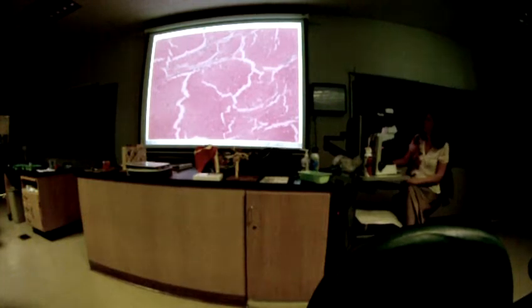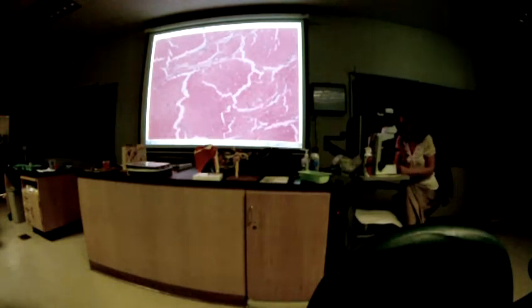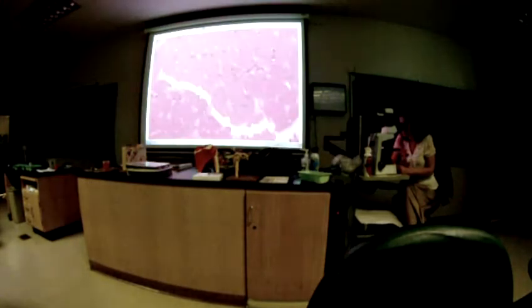We don't see the epimysium, that would be around the entire muscle. But around this layer right here? Perimysium. Yeah, that's the perimysium. Good. That's the collagen fibers. And we can get a little closer.